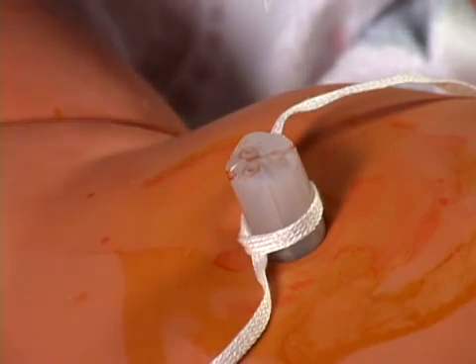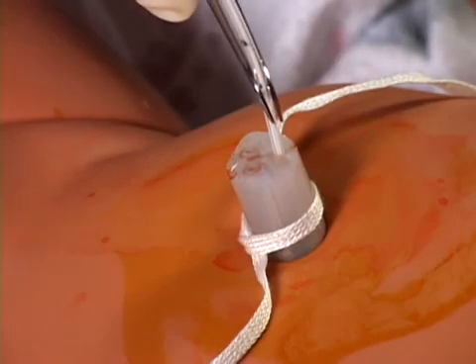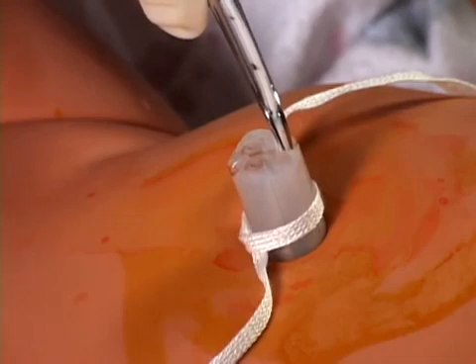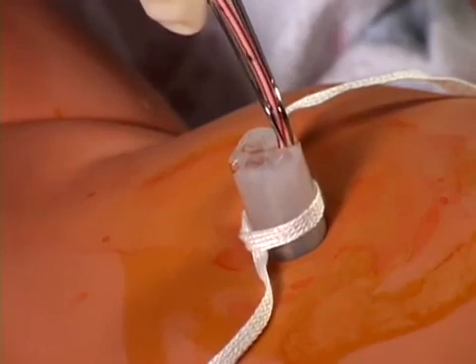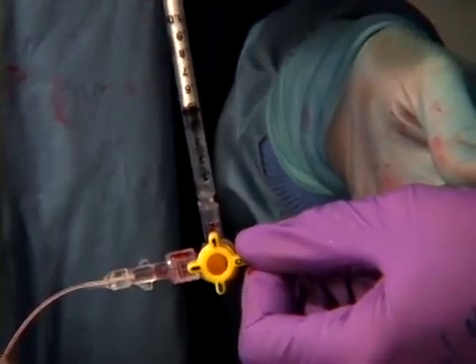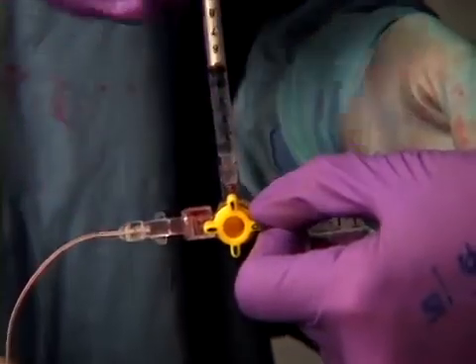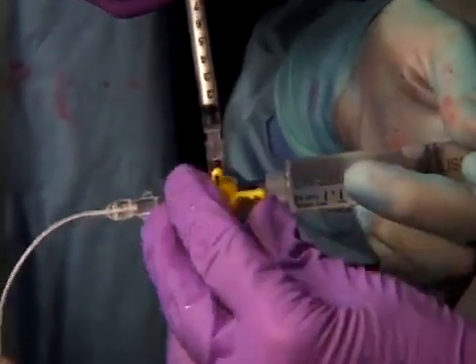Identify the umbilical vein as the largest of 3 vessels, usually located between 11 and 12 o'clock. Insert the umbilical catheter a short distance and open the stopcock. Advance the catheter while aspirating gently just until blood return is obtained. The insertion depth usually will be 2 to 4 centimeters. Hold the catheter in place as you resume compressions, clear the line and stopcock of any air, and administer epinephrine or volume expander.